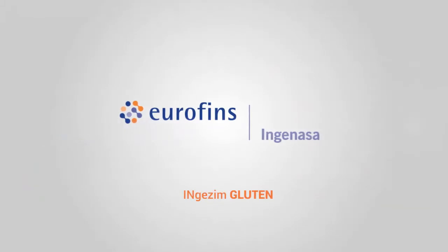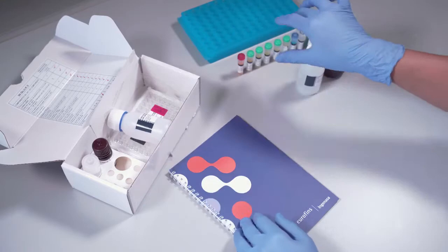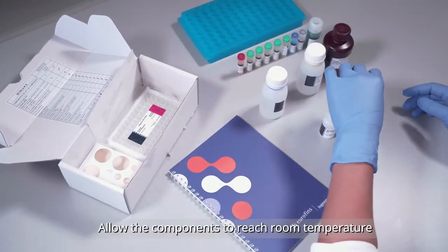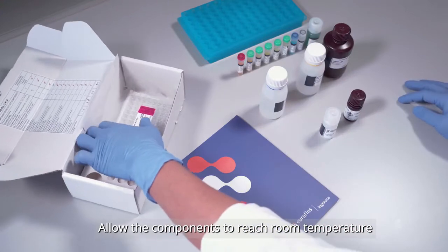IngeSim Gluten is an ELISA based on the R5 monoclonal antibody for the detection of gluten in foodstuffs and environmental samples. Allow the components to reach room temperature.